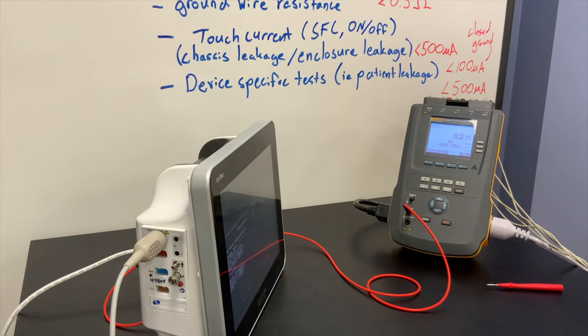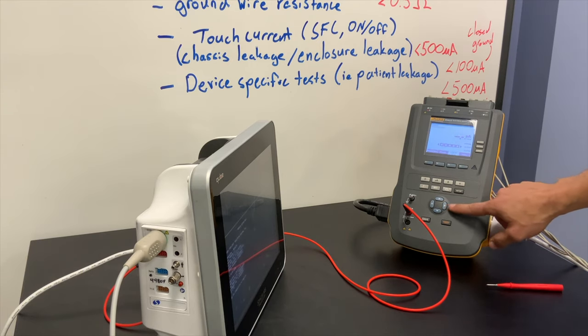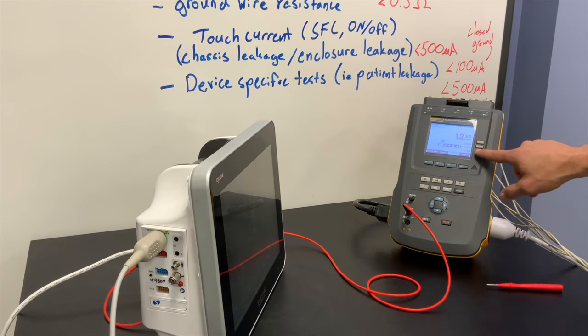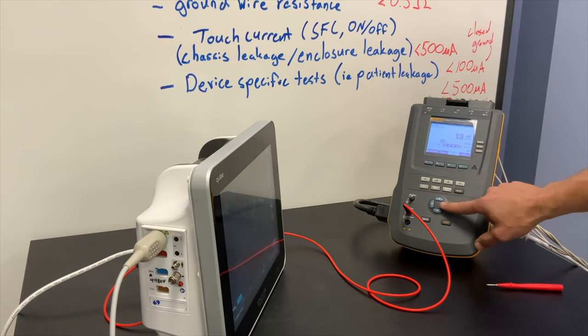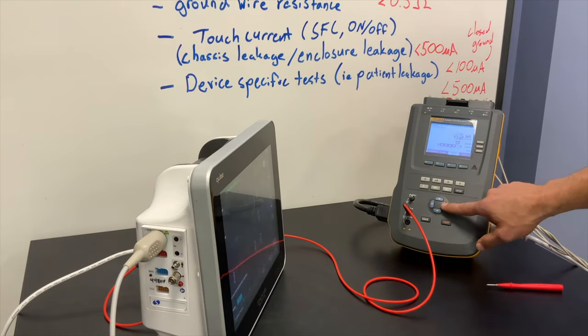You do want to run tests in both the on and the off states. So now I have normal polarity, neutrals closed, earth open, device on. I'm going to cycle through the different leads — all being under 500 microamps. They're all very low, which is what you would expect for a device like this.